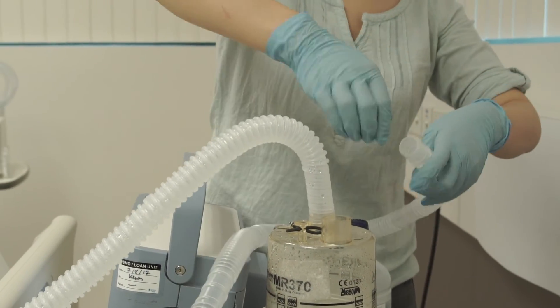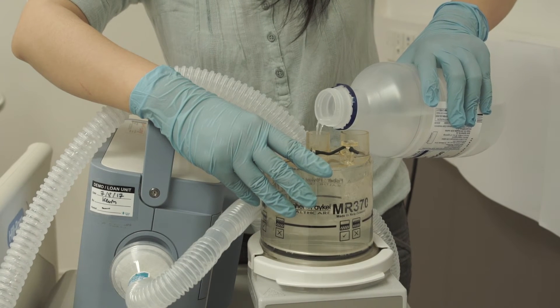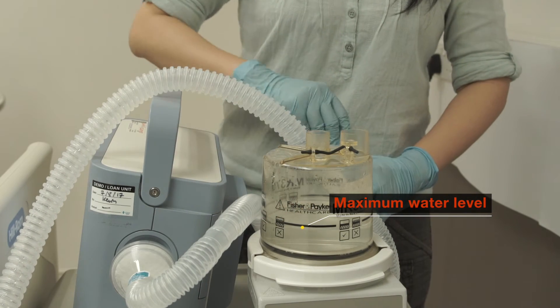When refilling, join the two tubes for ventilation. Fill up the humidifier chamber with sterile water until the marking. Avoid overfilling, as water might overflow and cause obstruction or damage to the machine.